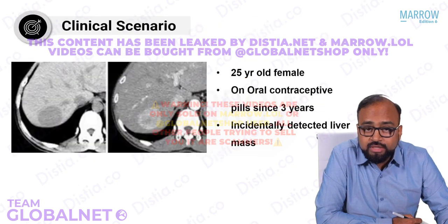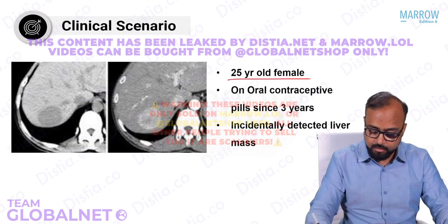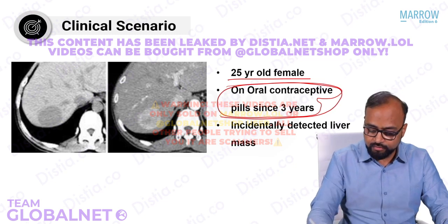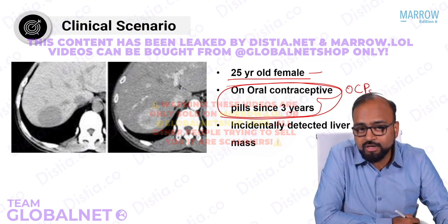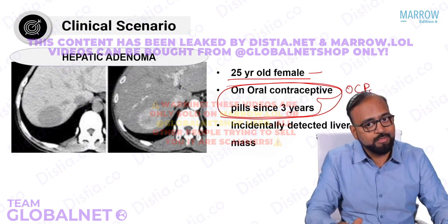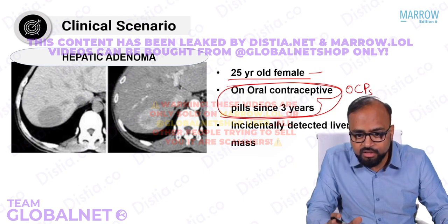Yes. Now look at this. This was asked as a recent question in one of the exams. See, a young female presents with a focal liver lesion, but what is the history? She has been on oral contraceptive pills for 3 years. So if you have a history of a young female on OC pills with a focal liver lesion, OC pills are associated with what focal liver lesion? Yes, OC pills are associated with hepatic adenomas. So these are also incidentally detected. A significant history is OC pills.